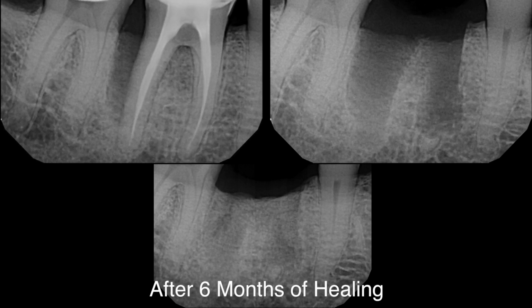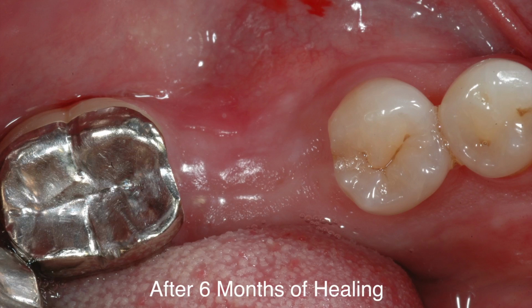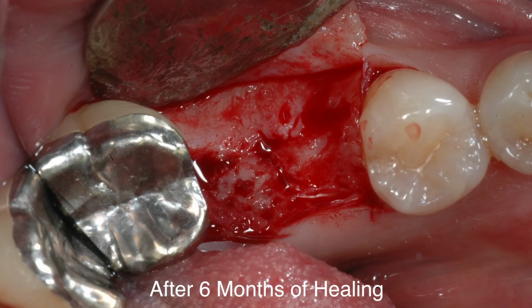Okay, this is 6 months post-extraction PRF placement. That's all we placed in the socket was platelet-rich fibrin and then covered it with a resorbable collagen membrane. Note that there is minimum, if any, vertical bone loss, and the alveolar crest is almost perfectly flat. PRF alone in combination with a resorbable collagen membrane has formed an ideal implant site.